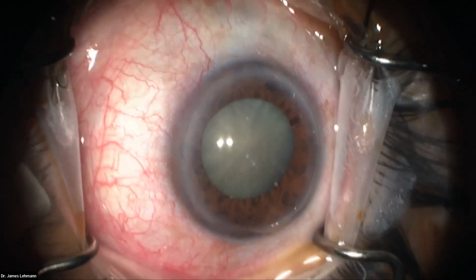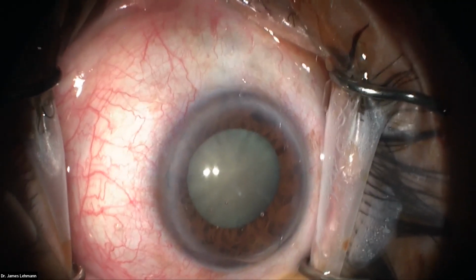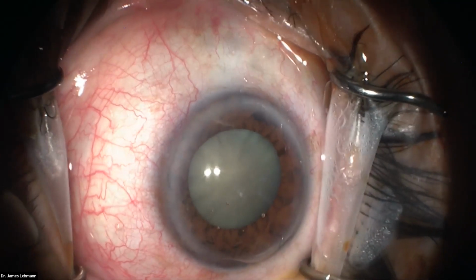Okay, so everybody have a good view? We can see and we can hear me? Everything's crystal clear, and sir, you're doing okay? All righty. So I'm just asking the patient, he's doing fine.